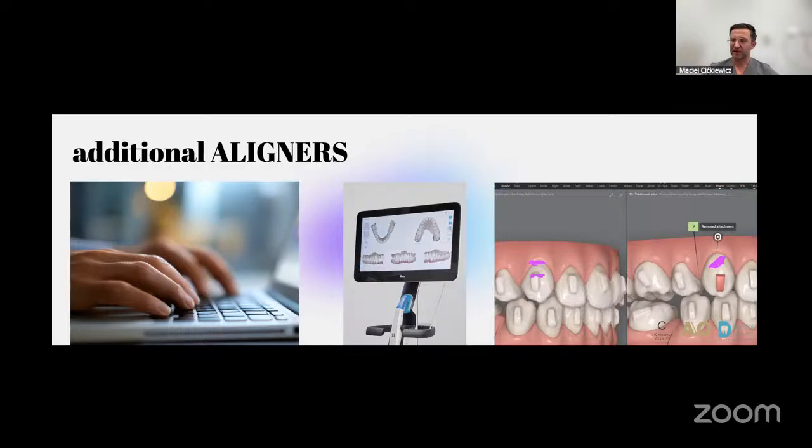So the CAD designers and also the laboratories want to limit the problems with the stiffness of the aligners, and then change the position of the attachment and make the limitation for us, and then create the removal of the attachment.